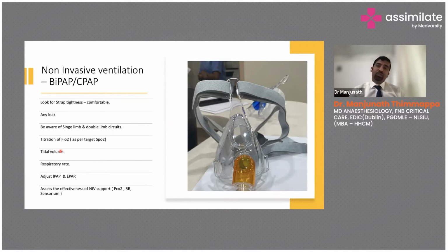If the tidal volume is at least more than 250 to 300, that means the CO2 is actually going to come out. The hypercarbia will reduce. If it is still around 100 or 150, it is still going to retain the CO2. So when you start patients on NIV, giving support and monitoring, it happens in the same way.